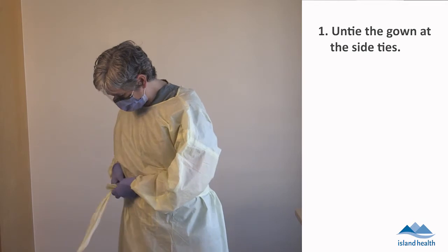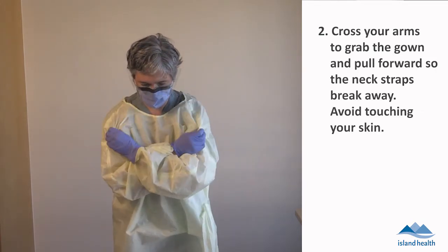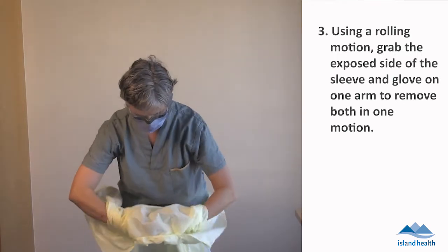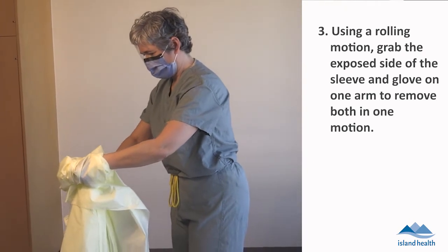Untie the gown at the side ties. Cross your arms to grab the gown and pull forward so the neck straps break away. Avoid touching your skin. Using a rolling motion, grab the exposed side of the sleeve and glove on one arm to remove both in one motion.